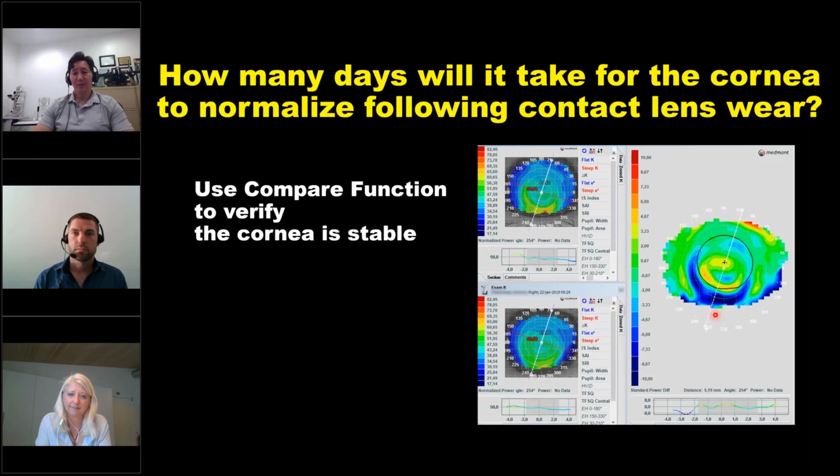And we did something like this that Nikki was recommending, from month to month, and we would compare last month to this month and see if there was a difference. If it was green, then we knew that the eye wasn't moving, at least between those 2 visits. If the eye is showing yellow, as Nikki has shown here, or blue, that eye is still moving.